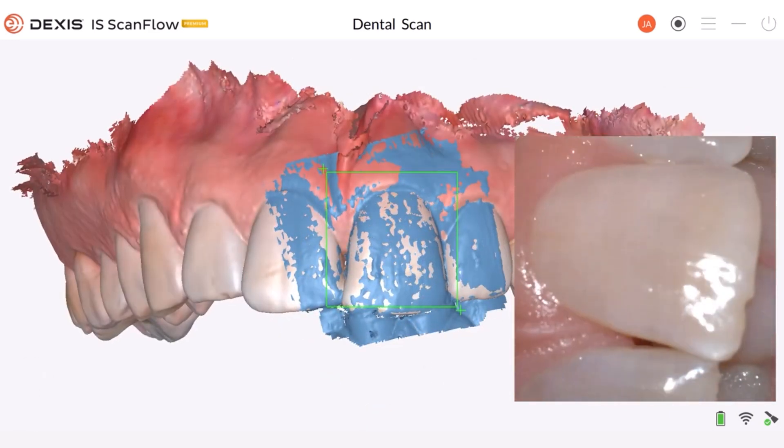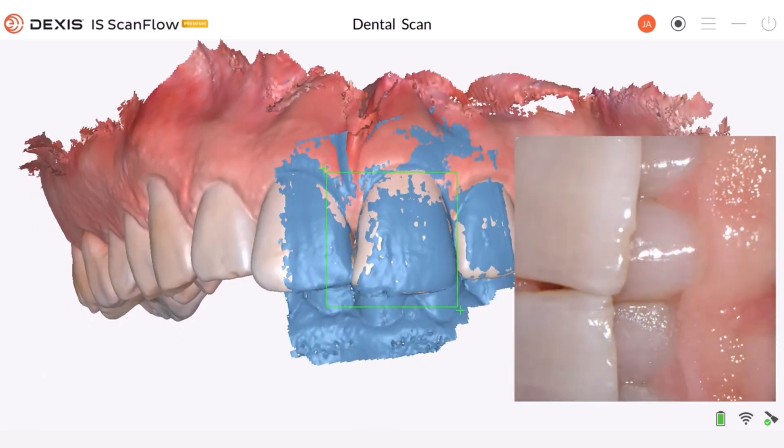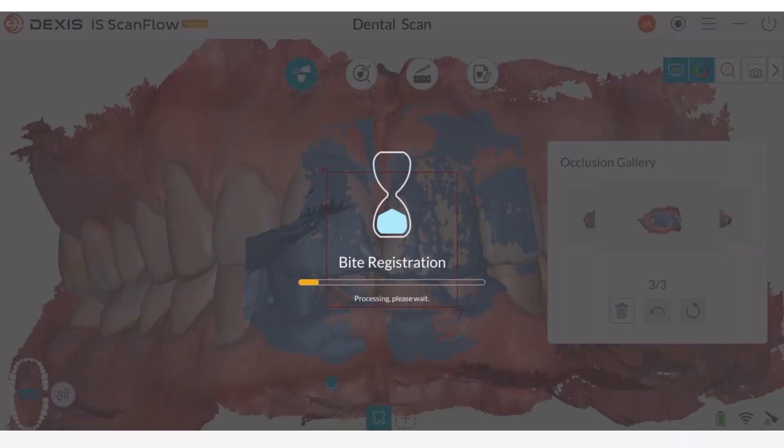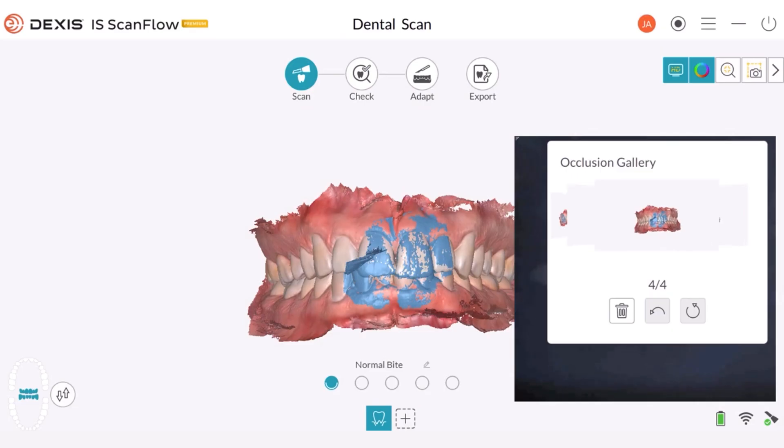Remember that for a partial arch, you should acquire at least three buccal bite images: one on the preparation, one mesial to the preparation, and one distal to the preparation. For a full arch, you should acquire at least four buccal bite images — one on each side of the mouth at the molars, and one on each side of the mouth at the canines.